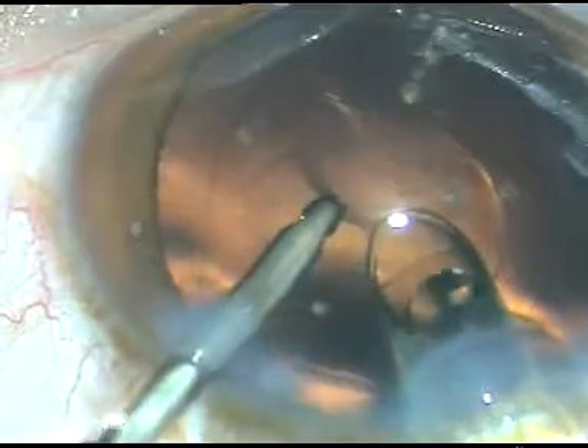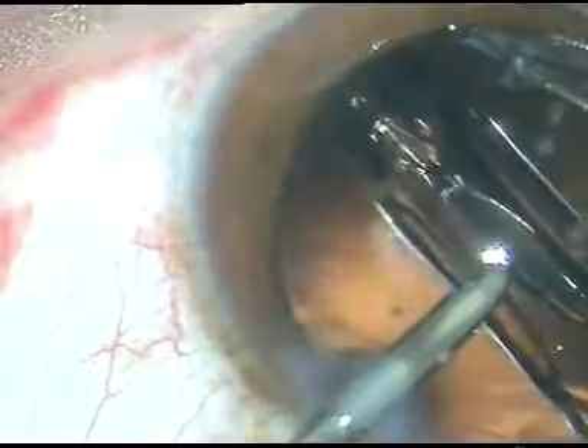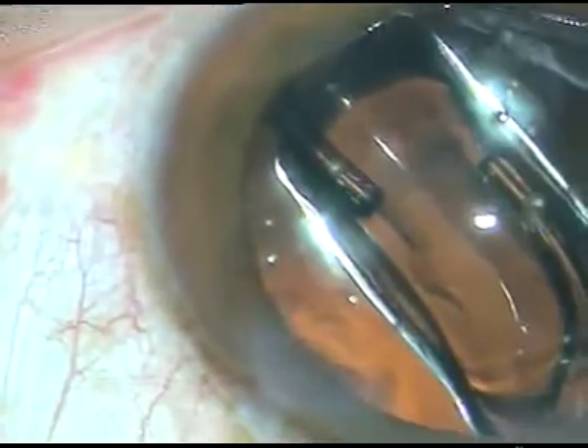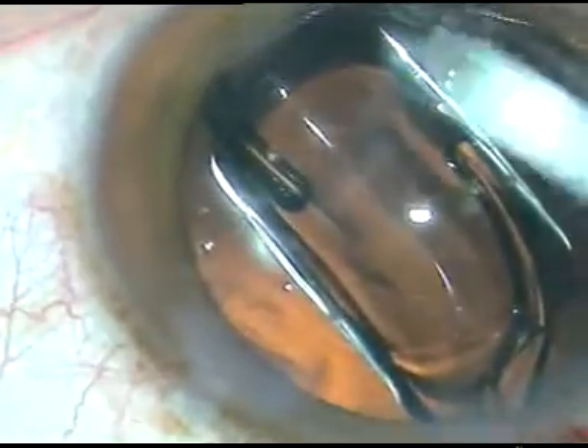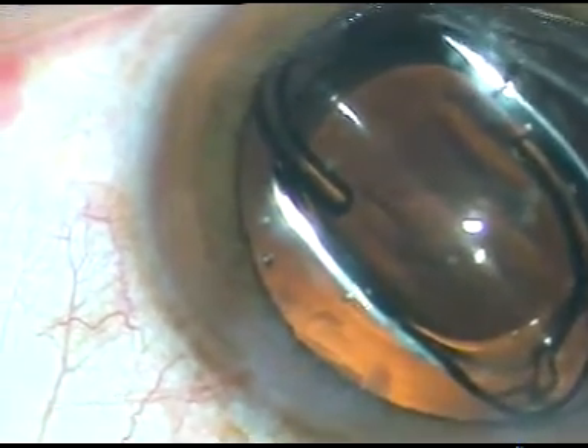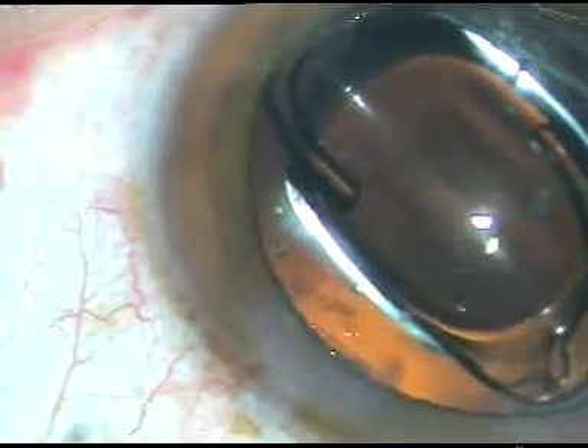A hydrophobic acrylic intraocular lens is being implanted under irrigation. When these lenses are implanted under irrigation, it takes a little longer time for the hydrophobic lens to open in BSS.